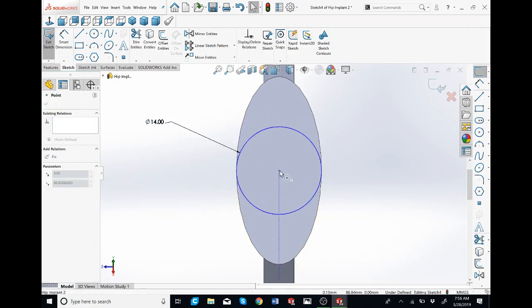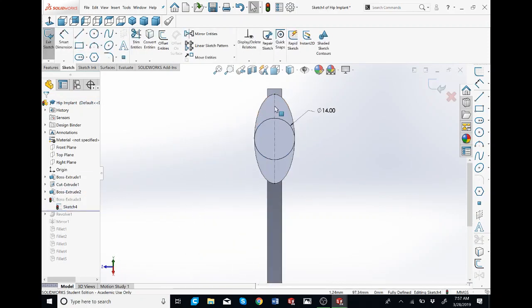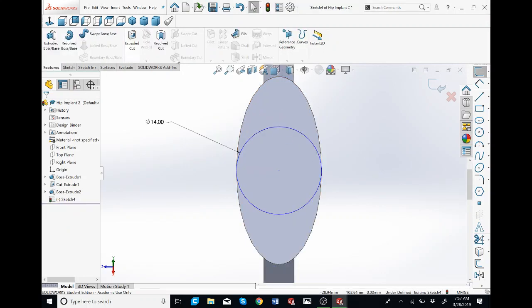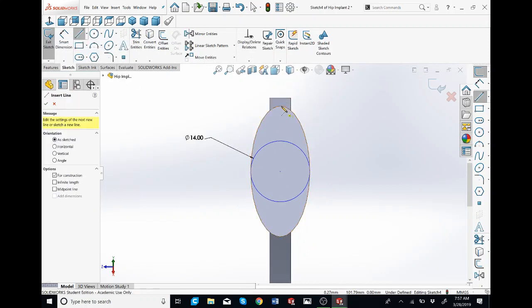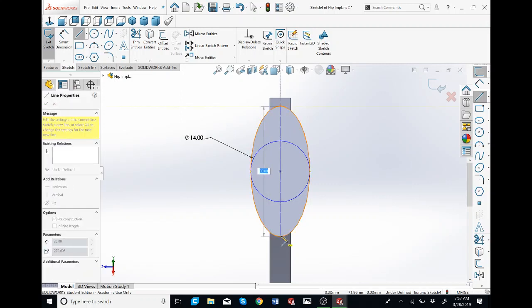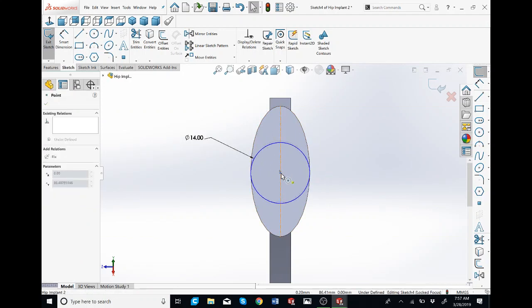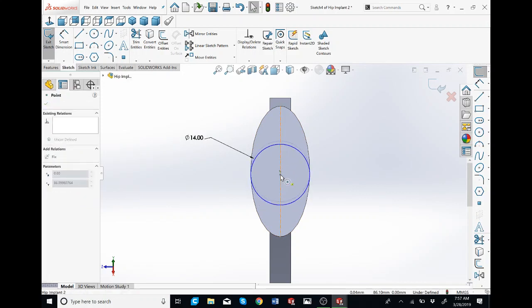You can see that I could move it around. I believe I made a center line in the middle. So if you see my sketch over here, I made a center line going from the top to the bottom. I'm going to do the same thing. So I'm going to sketch tab, click on this, center line, hover over, click on this point, all the way down to this point, press escape. And now if I move it, you see that point in the middle. So I'm just going to attach it onto there. Didn't work. There you go. So now it attaches on and is fully defined.